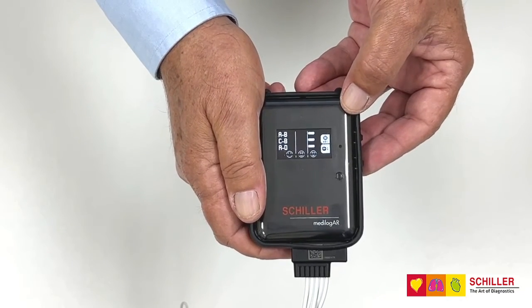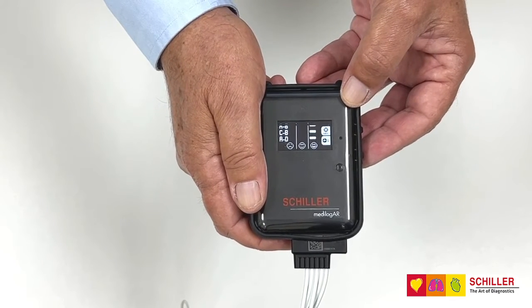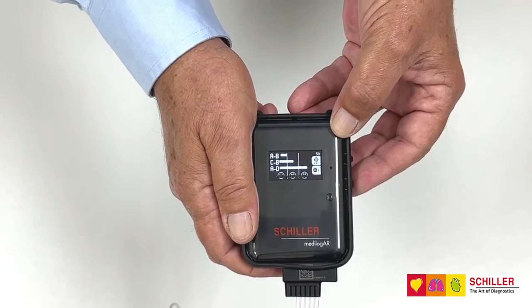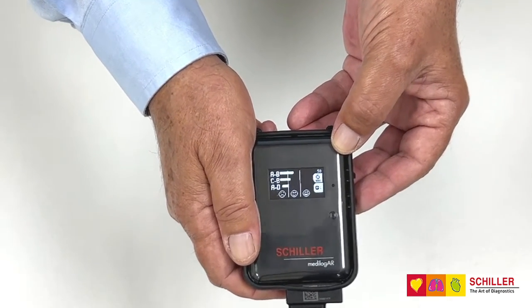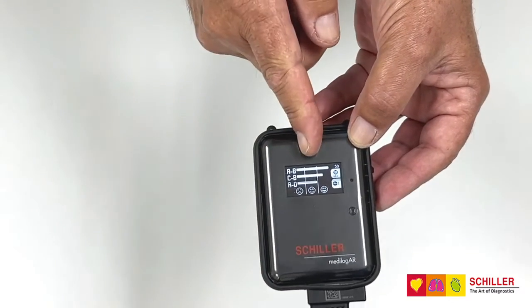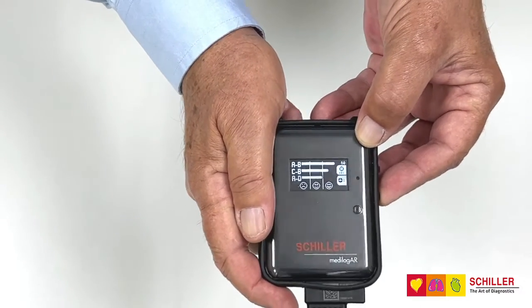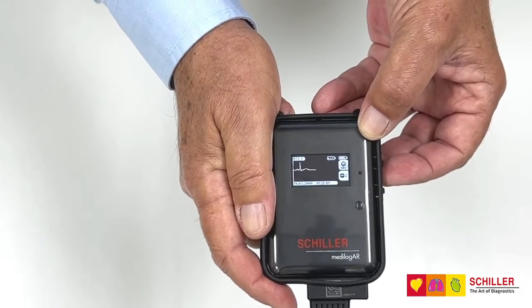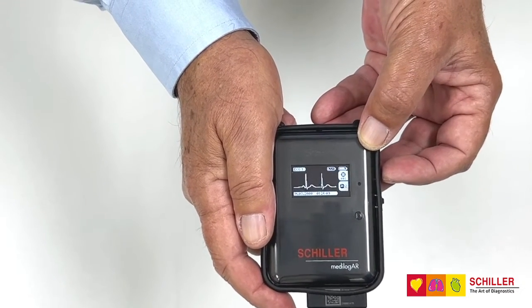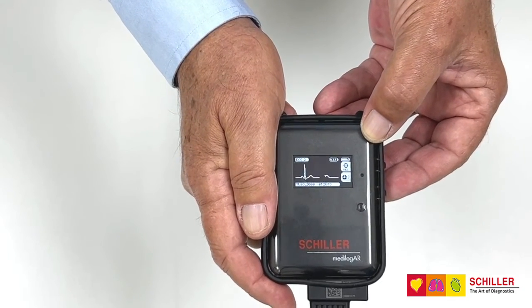At this moment the system is searching for the best quality to have on the recording and evaluates where you are. What you're looking for is always having quality from good to excellent. Once you have this, press the lower button and you can check the signal quality on channel 1, then the upper button to start the recording or the lower button to check channel 2.